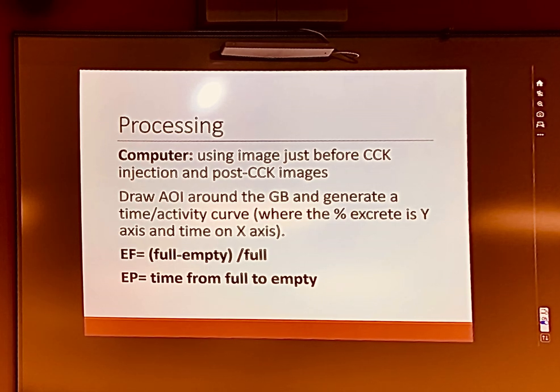I thought some of the cameras had automated things where they could detect motion and try to fix it. No, girl, no, they don't do that. For a stress test, they will. Oh, okay, maybe that's what I'm referring to. However, guess what? If it moves more than 2 pixels, you have to rescan the patient. I remember saying that, okay. That's probably what made me know, because I remember the 2 pixels.